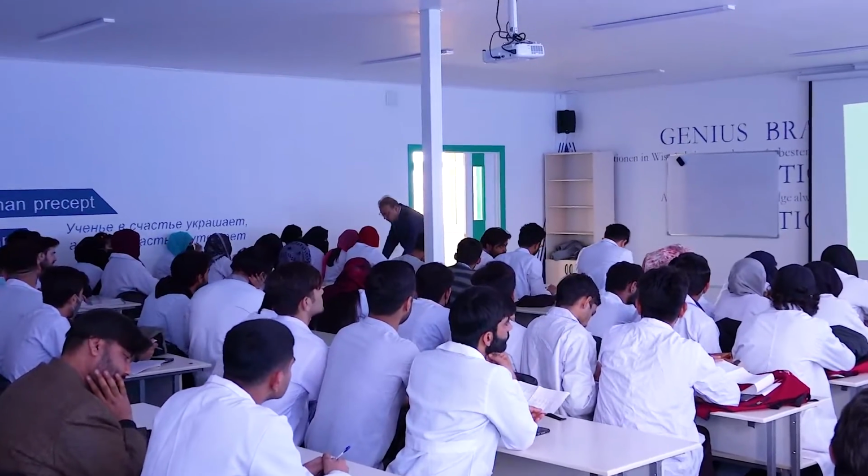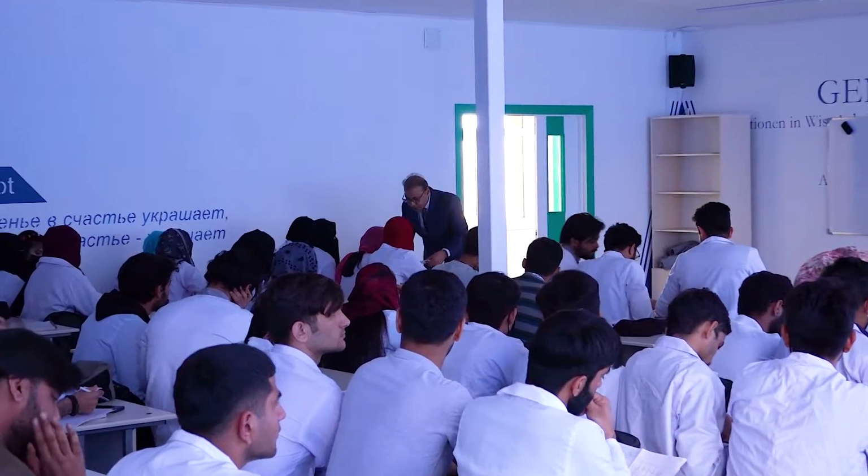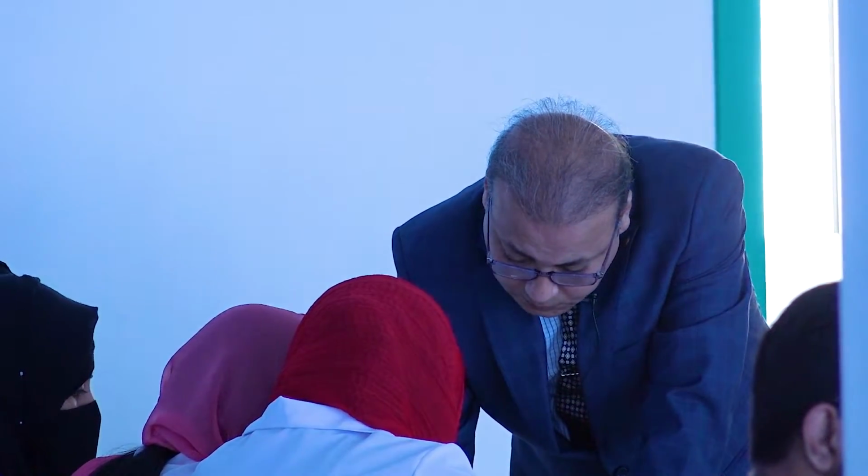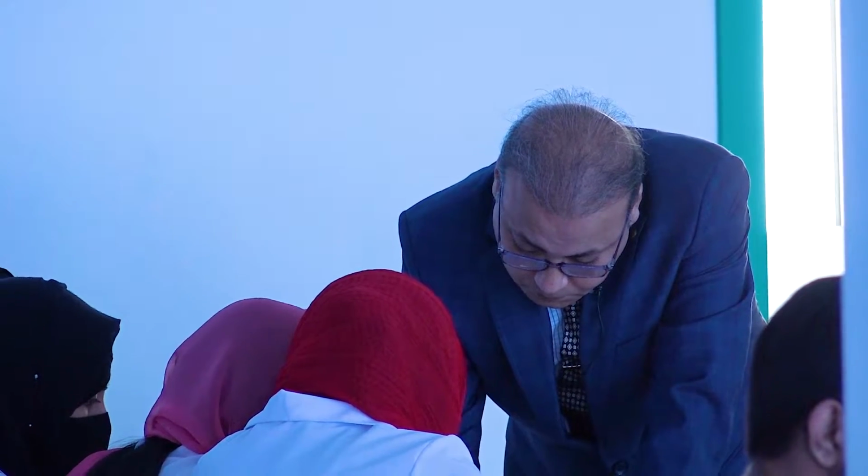We are talking about when the first ECG paper comes to you, you have to first see the speed of the paper, because the speed of the paper is needed for further calculation. Just you see Q and T.